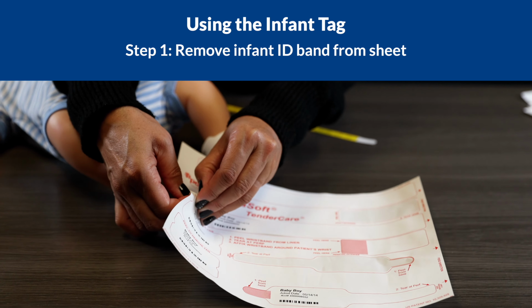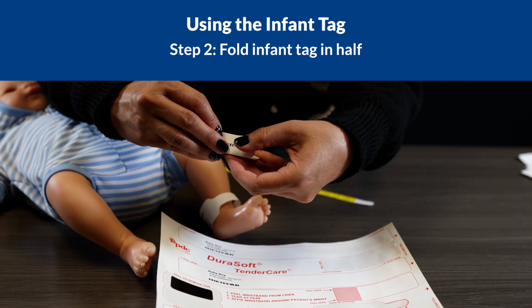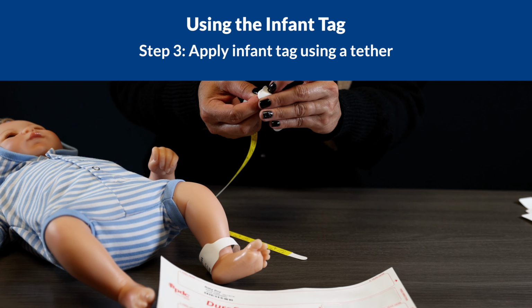Simply peel the tag off the sheet, fold it in half, then apply it to one end of the tether using the slit in the tag. The other end of the tether loops securely through the infant's ID band.